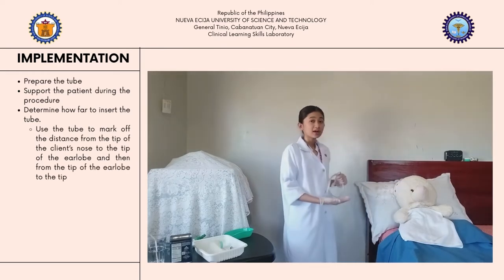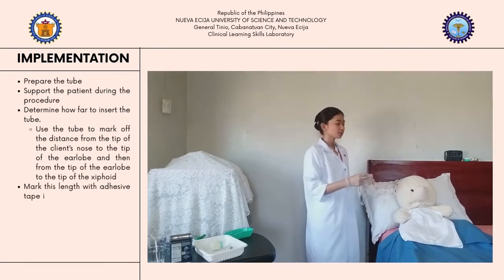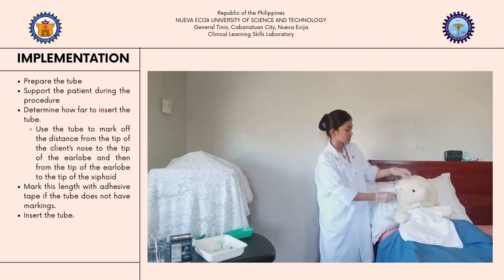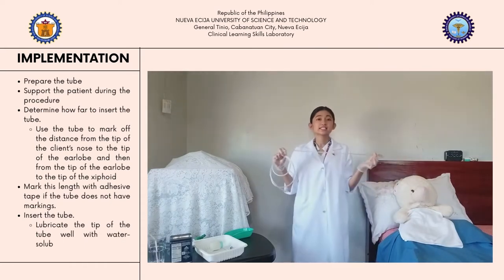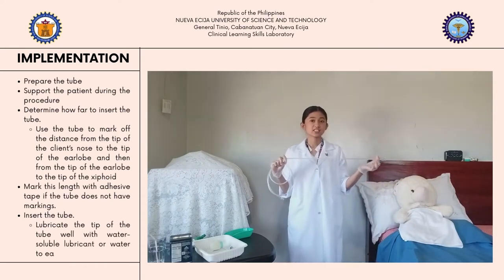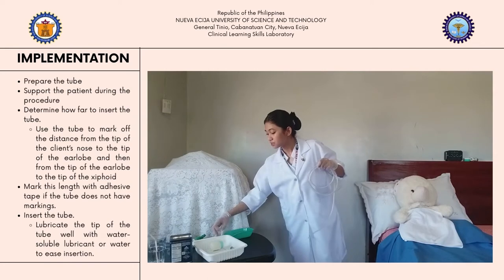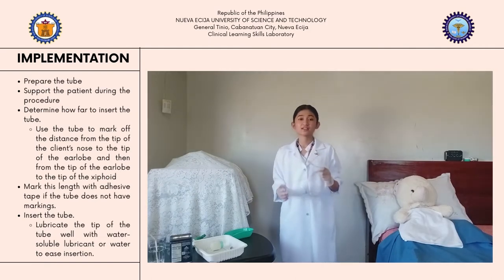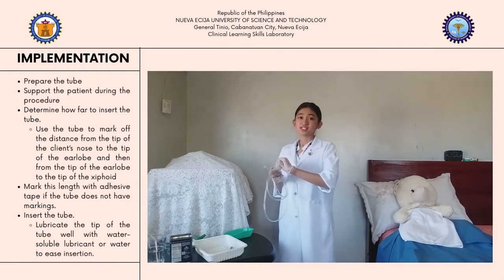Then, we need to support our patient during the procedure, and then determine how far to insert the tube by using the tubing to mark off the distance from the client's nares to the tip of the client's earlobe, and from the earlobe to the tip of the xiphoid process. This length will approximate the distance from the client's nares to the client's stomach. And since the tubing does not have any markings, you can use an adhesive tape. Then, lubricate the end of the tubing well with a water-soluble lubricant or water to make the insertion easier.